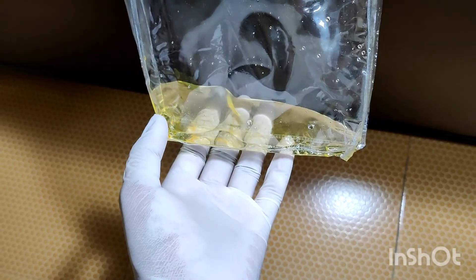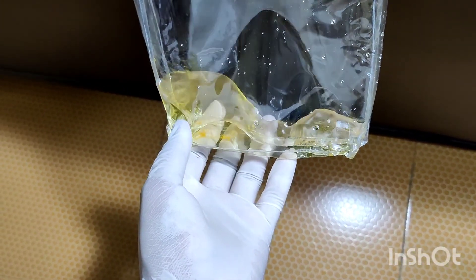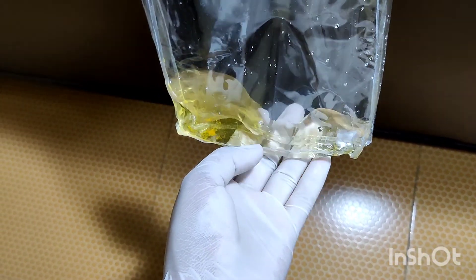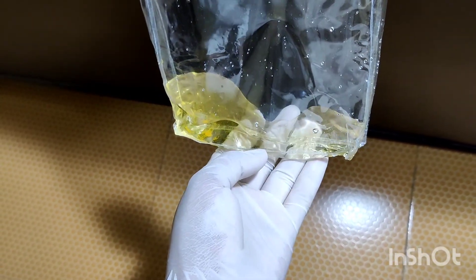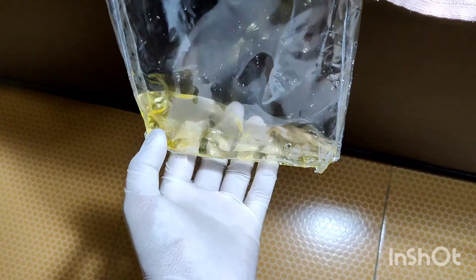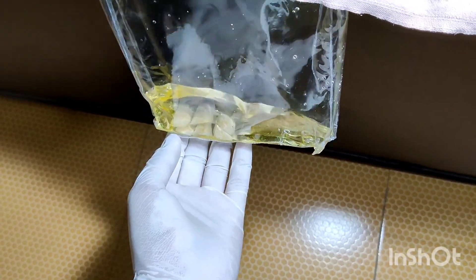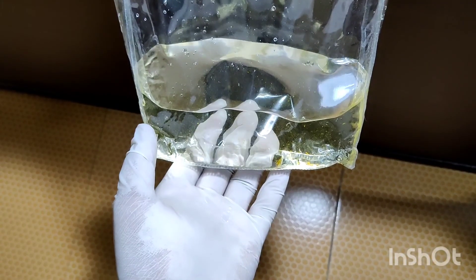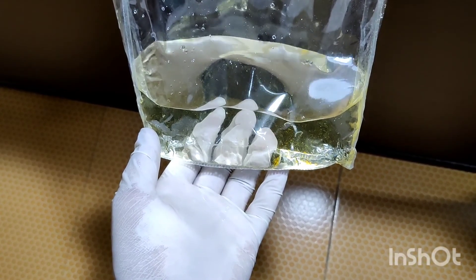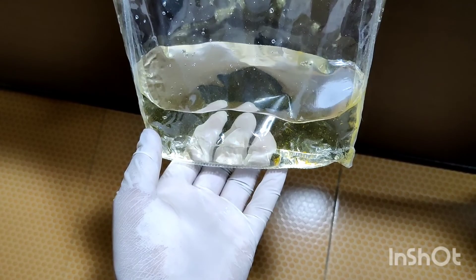Check for the urine output in the drainage bag and look for any change in color of the urine or any presence of blood in the urine, then report it to the nurse. The observation in the first hour shows 50 ml of urine in the drainage bag. Urine output is observed at 280 mls in four hours, so we can say the patient is having normal urine output.